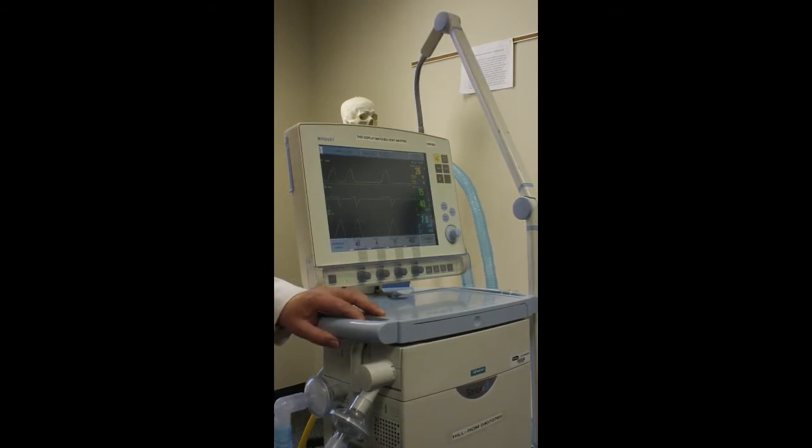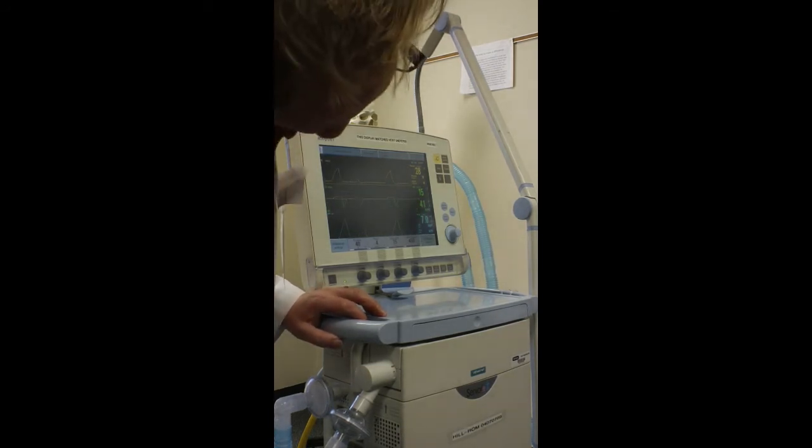But if a restrictive lung disease is happening, like ARDS, where we have fluid, inflammation, things like that, and your pressures are increasing like that, your patient's getting worse. Your pressures are going to keep getting worse, which is why you want to switch them over to pressure control. Does that make sense? Okay. So that's PEEP. The actual PEEP reading is what goes here. So here our PEEP is 4.